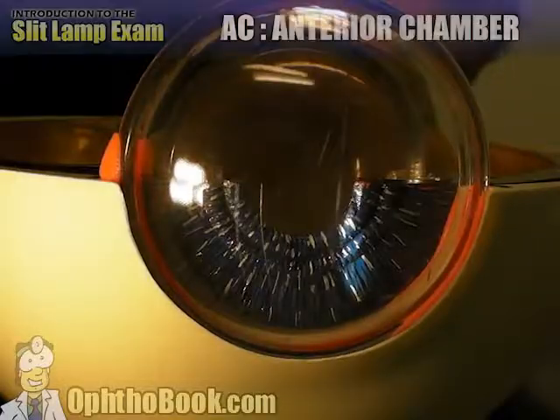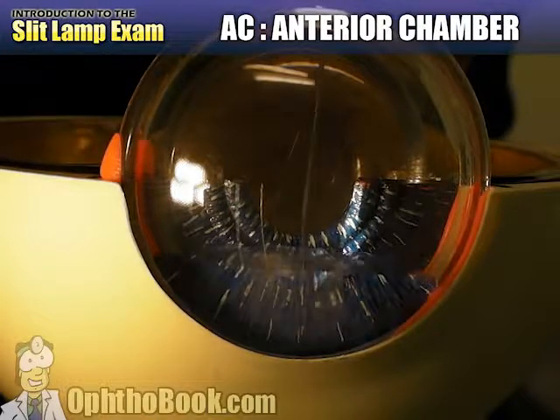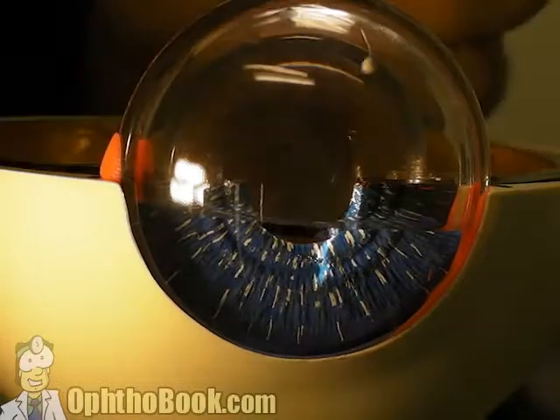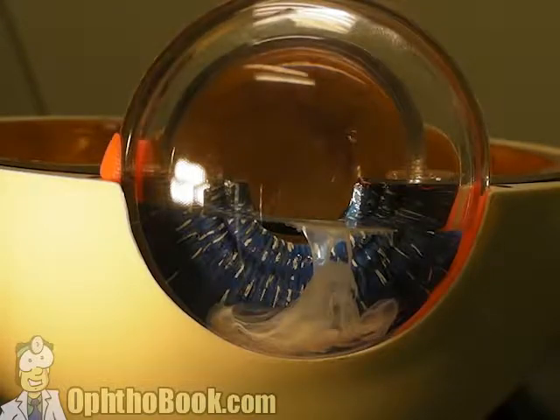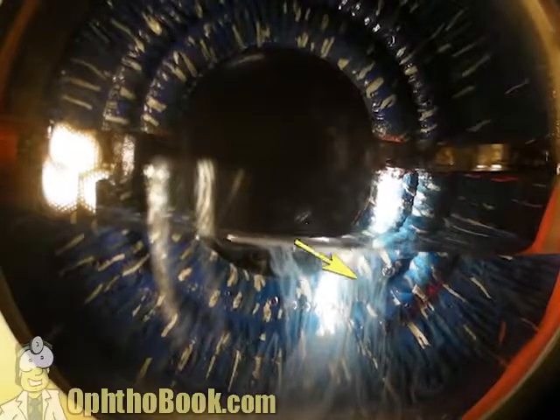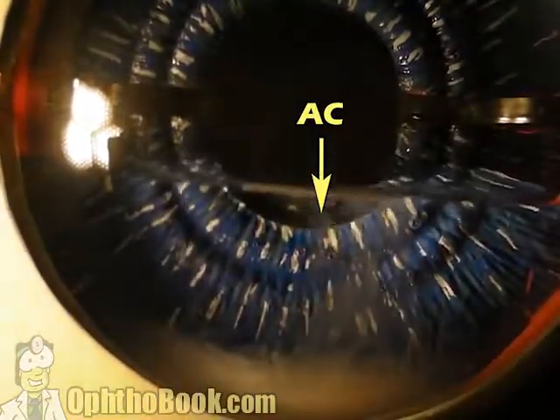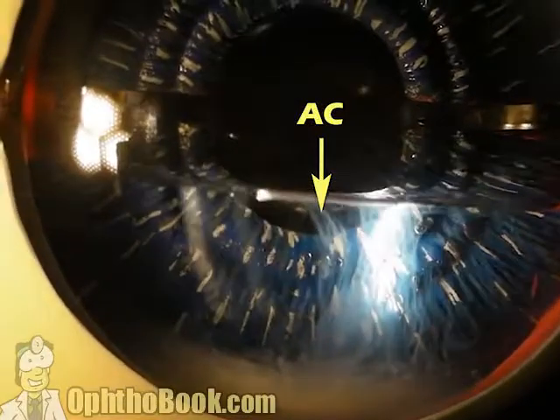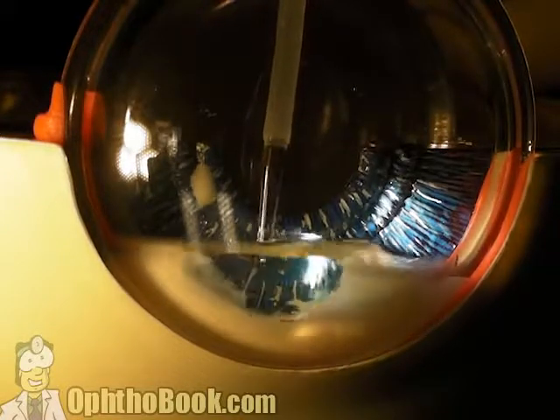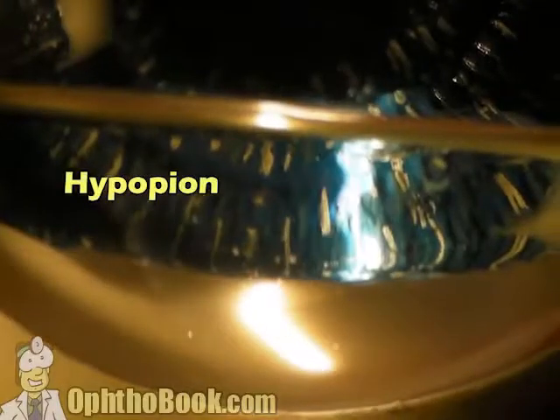Moving on to the anterior chamber — basically the fluid-filled space between the back of the cornea and the surface of the iris. When looking at the anterior chamber, I find it helpful to angle my beam so it strikes the back of the cornea to the left and the iris surface to the right. Using the pupil as a black background makes it a lot easier to see things floating in that space. If you have enough inflammatory cells, they sink and form a layer of pus in the bottom of the anterior chamber — this is what we call a hypopion.